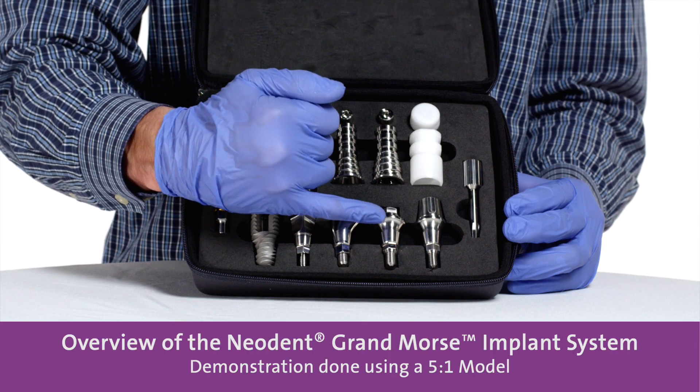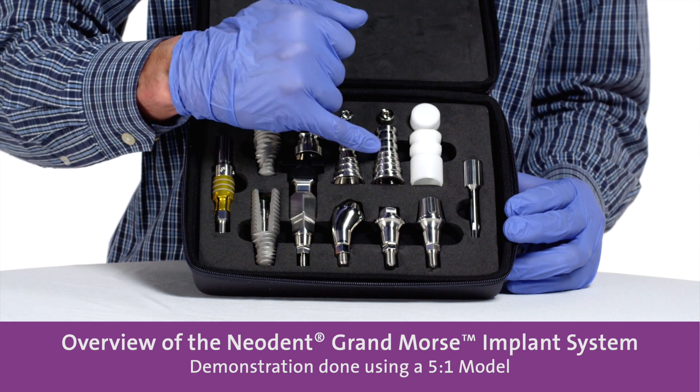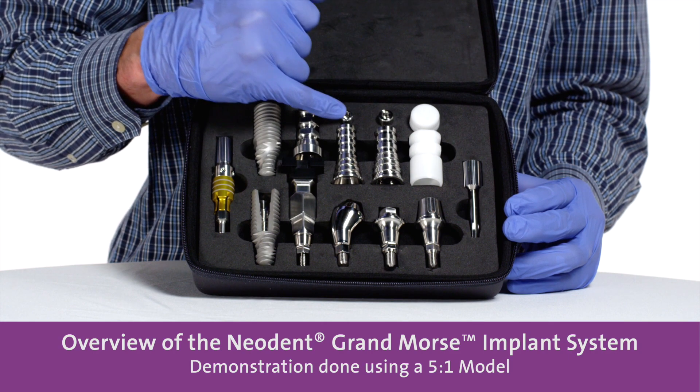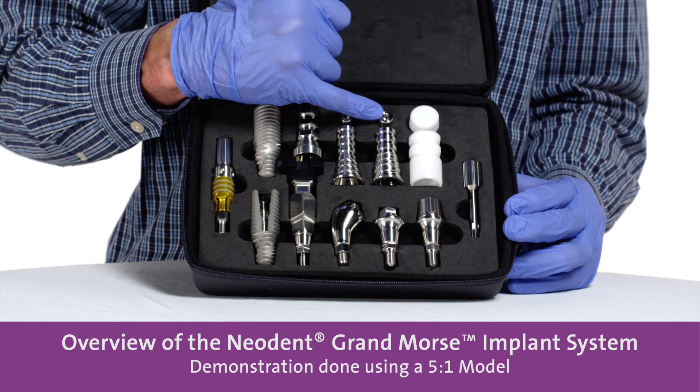This is an abutment to do single unit screw retain with the respective titanium coping as well. And this is the occlusal coping for the mini conical abutment. This is the occlusal coping for the GM abutment.